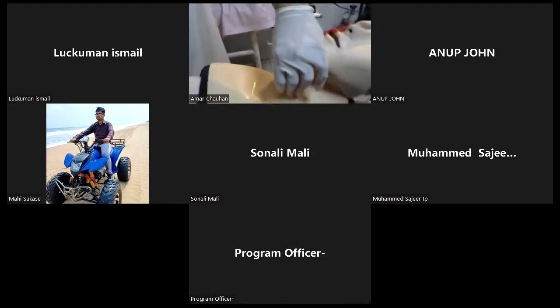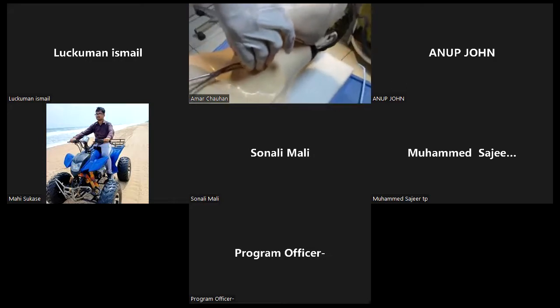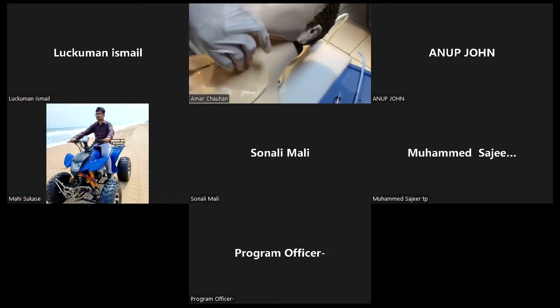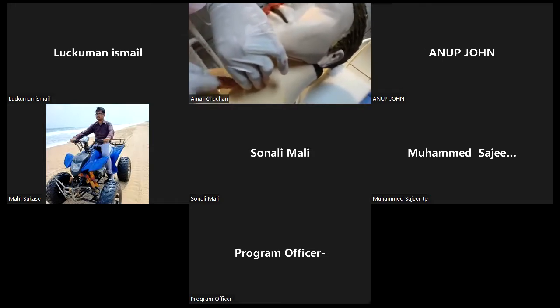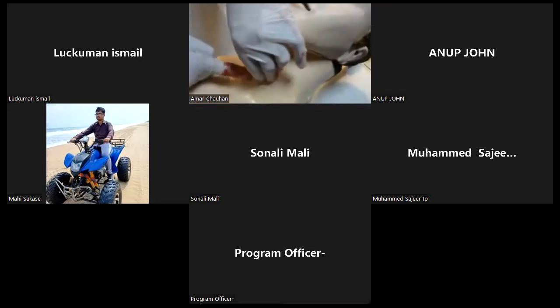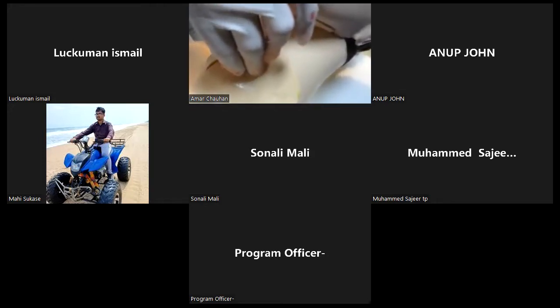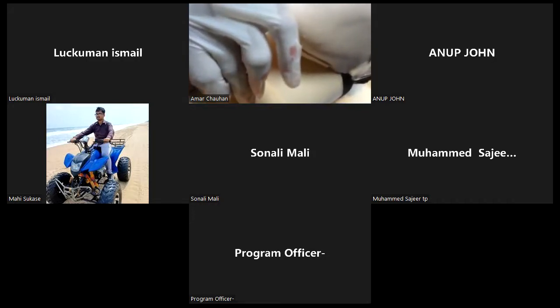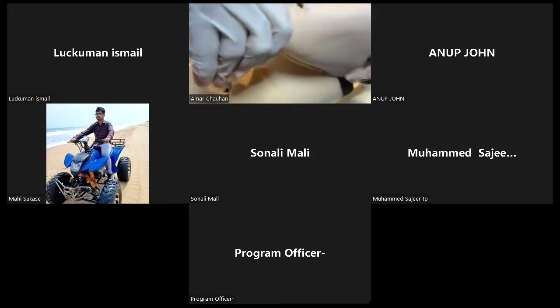And then do a dissection, a blunt dissection, and another stab. Now we have reached the area, and dilate with your fingers. You can hear the hissing of air. Now we will pass the bougie. Never leave the space. Pass the bougie, and over the bougie, pass the tracheostomy tube.